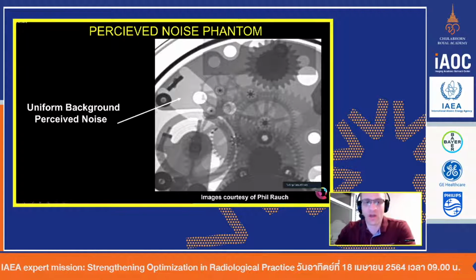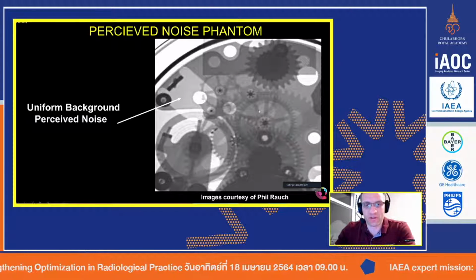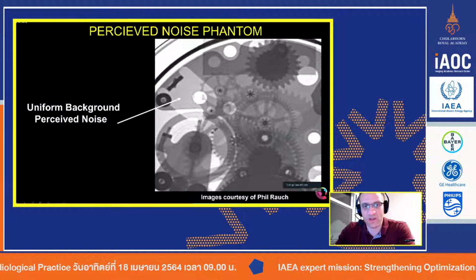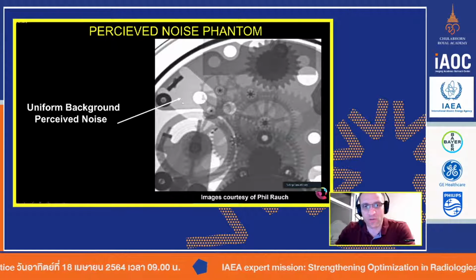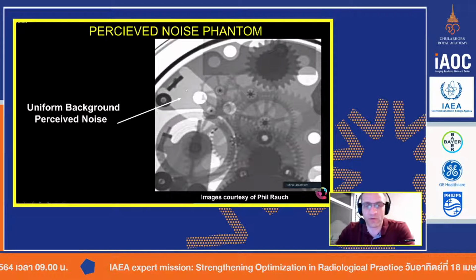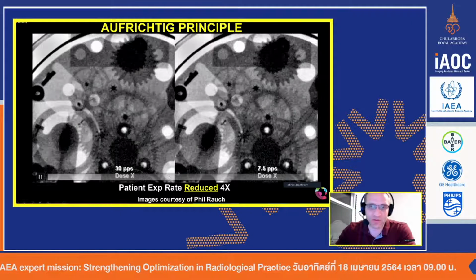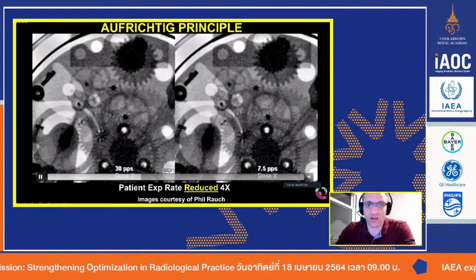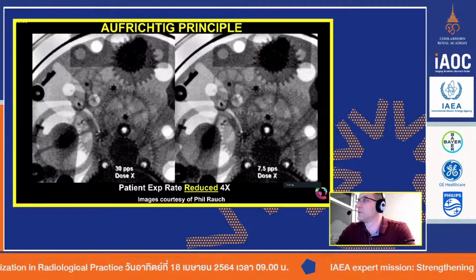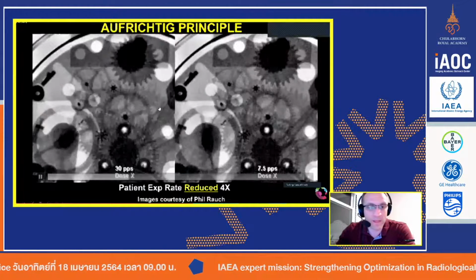Here's a watch. And the next couple of slides, I'm going to show them to you in real time. So all the gears are going to be moving. So just look at the overall noise as you go through this. There are a couple of areas of uniform background. If you want to really just focus your eyes on that area, that might help you with your ability to see the noise. And once again, I really truly hope this presents to you really well. Actually, what I'll do is I'll optimize for video clip. Hopefully that might help a little bit.